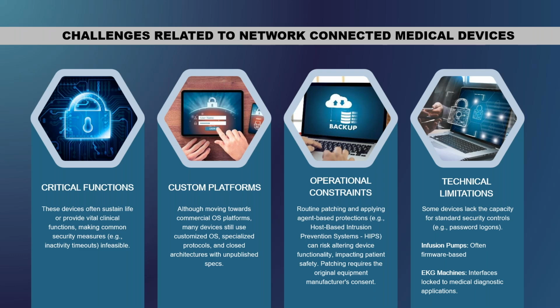And then we also have the technical limitations. Implementing those devices, they lack standard security controls, like password logins. If you use infusion pumps that are firmware based, you can't necessarily change the inherent password. And for EKG machines, interfaces are locked to a certain medical diagnostic application, so you can only use Muse applications with the GE, or things like that.